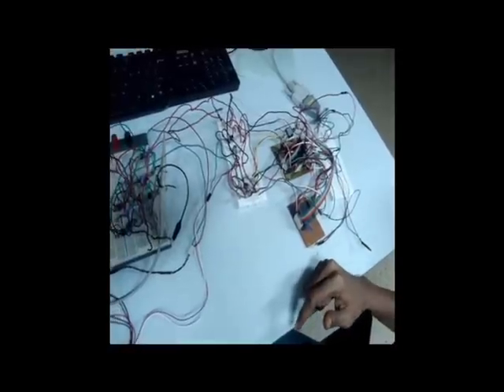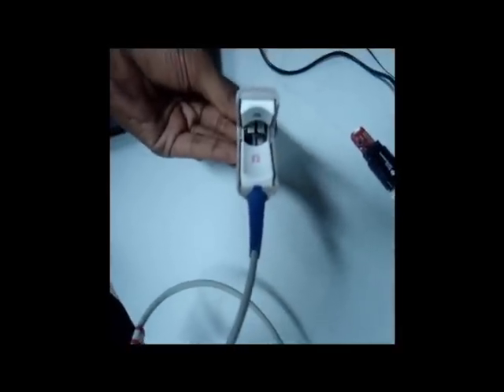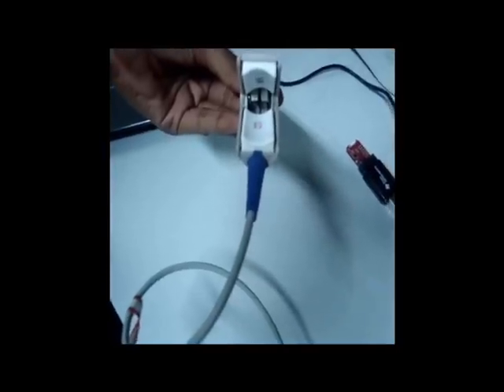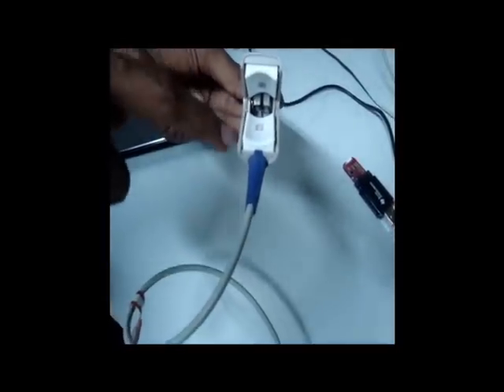The analog front end starts with the probe. The probe we have used is a Nellcor DS100A probe. It consists of two LEDs of different wavelengths. One is the infrared LED of wavelength around 940 nanometers and one is a visible red LED of wavelength around 650 nanometers. There is also a photodiode which is placed opposite facing the two LEDs.